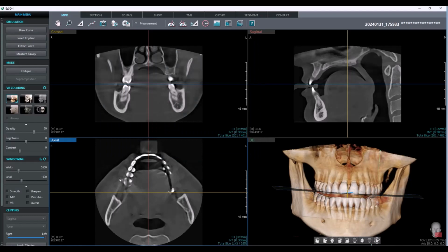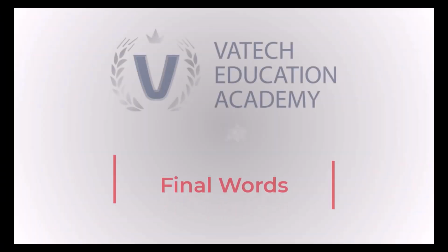This was meant to be a brief tutorial to get you started navigating the software. You can find additional training modules in the Vatech Education Academy, which will guide you through your process of learning this software.